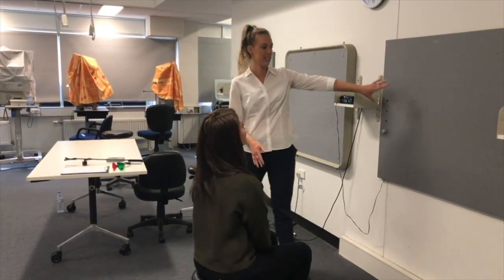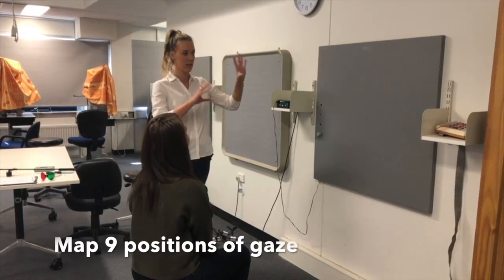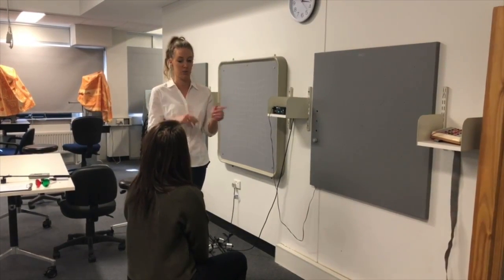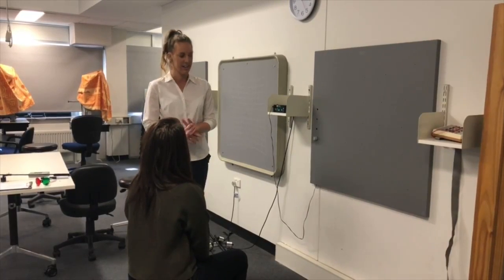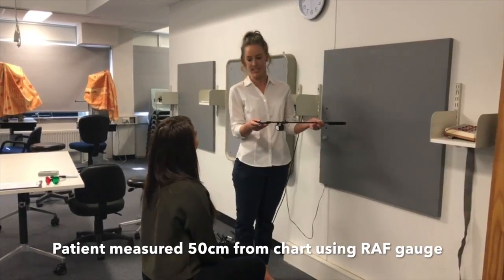Now what we're going to be using is this machine here, which is called a Hess chart. Now what we're going to do is we're going to get you to look in 9 different directions, and as we do this we're going to be looking at how your eyes move when we tell you to look in these directions. Now to get you set up, I'm going to use this contraption here, which is going to measure 50 centimetres from the chart.